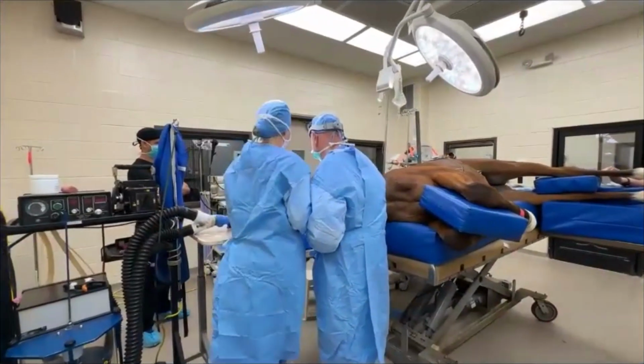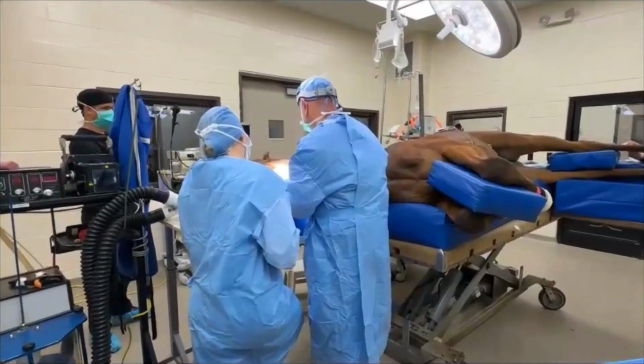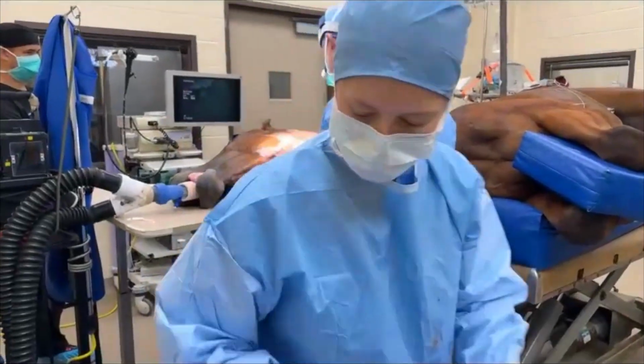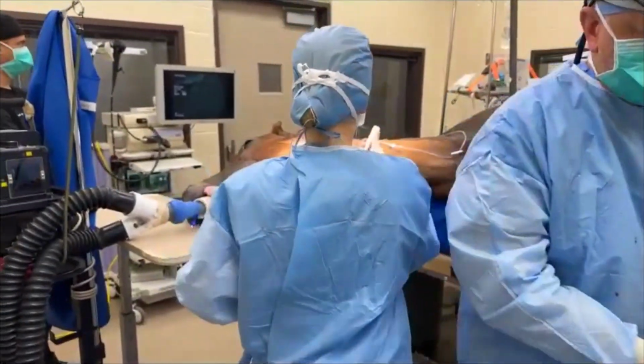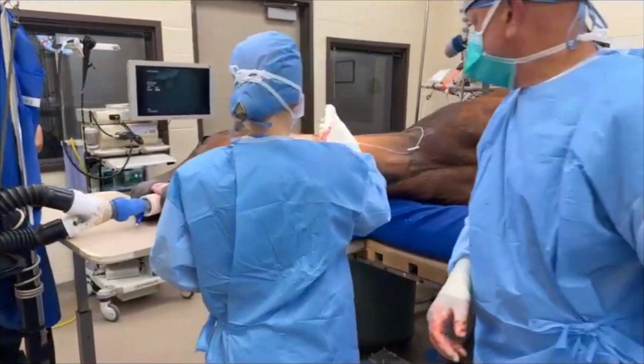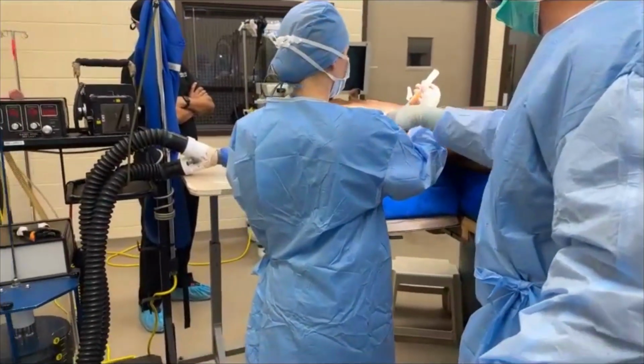Okay. Well, when I first watched the video, I was wondering at the end, what is that tube and that little bulb at the end? So thanks for the explanation. So that helps with the drainage. It's just a suction drain. Yep. And I think probably not very many people use that, but again, it's helped me out on these things.